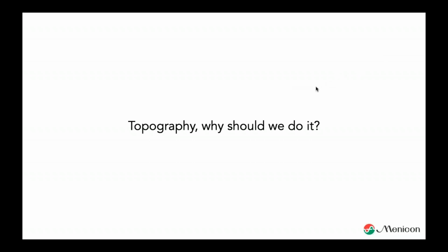Well, one of the main reasons for that is that we want to gather as much information as possible. And the topographer device gives us the possibility to gather that information. We get so much more information of the eye that we can look differently at eye shapes. We start learning from topography, and we start thinking differently about lens fitting, but that's later on. I put on my webcam again because I think talking to you is more personal.